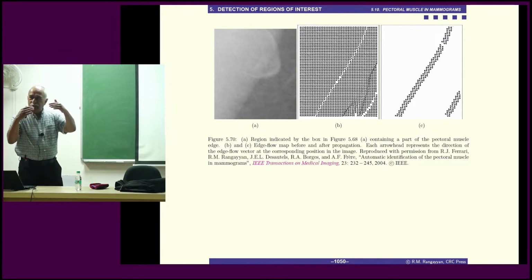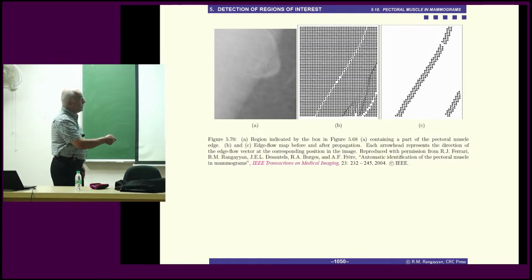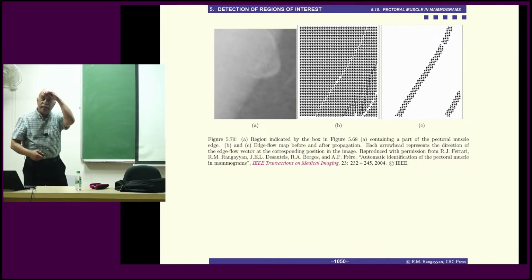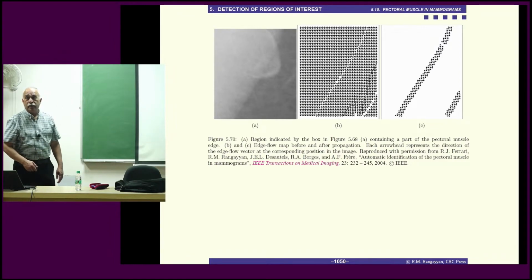So when you have opposite phase, then that is where you have the edge, because you have the gradient this way and gradient that way, and that's where the edge lies. So by finding these pixels, and there is one more step here, we get the edge, or edges, as many edges as are present in the image.